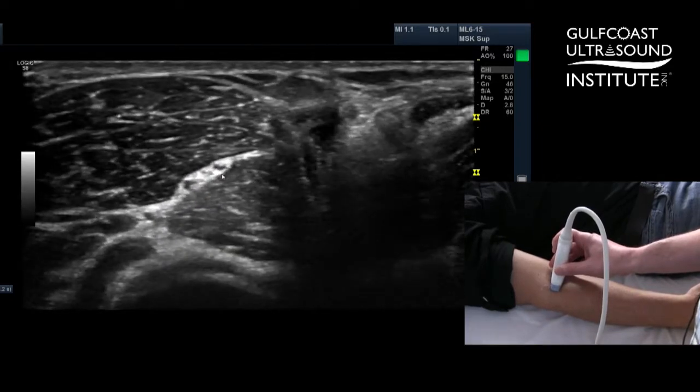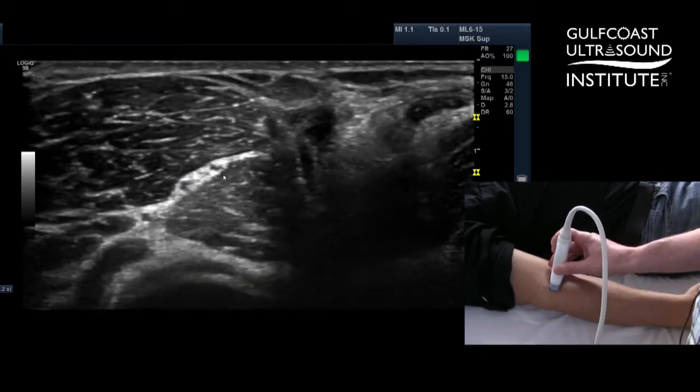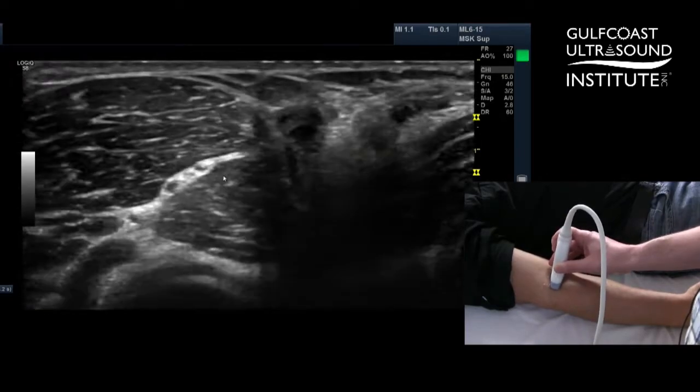Between these three nerves — the radial, the ulnar, and the median — you're able to block the whole hand of your patient. Now that's your hot tip of the day. Give it a try.